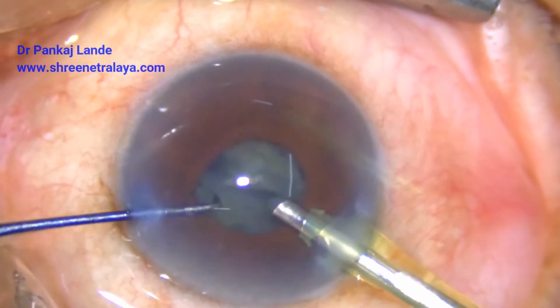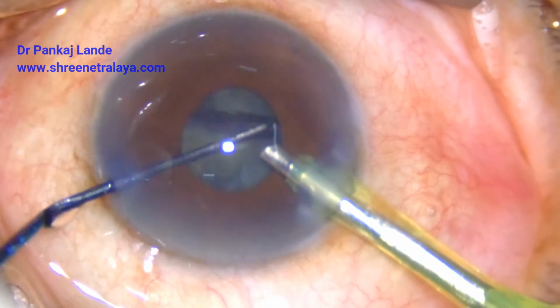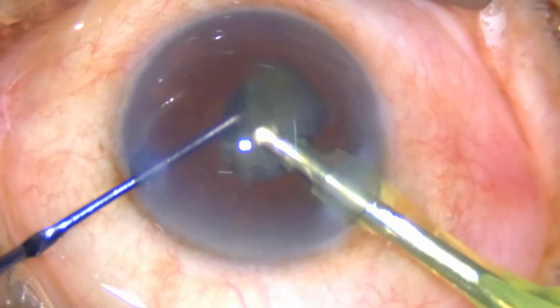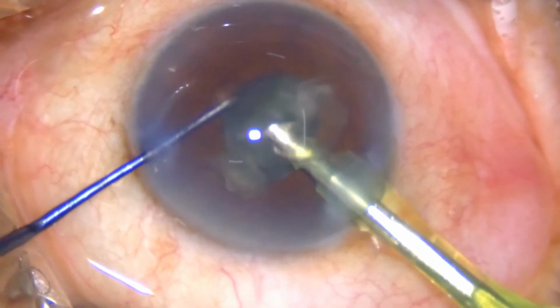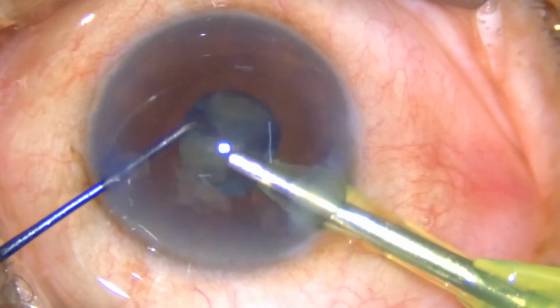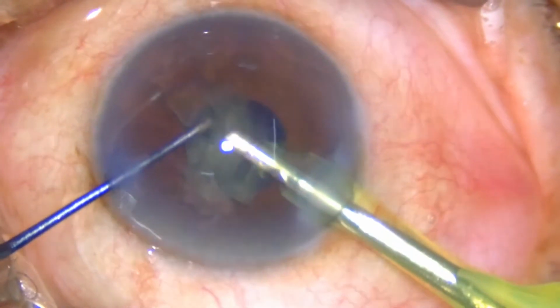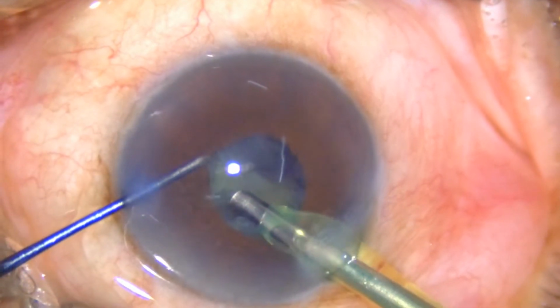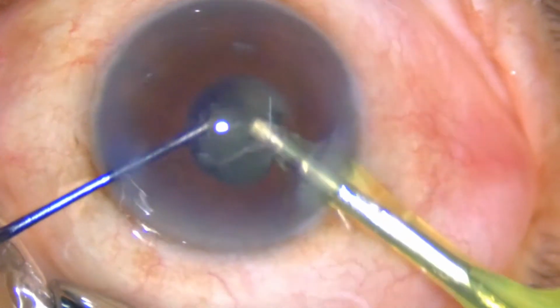If you can't chop, just keep rotating the nucleus and keep eating away the superior pole, cortex and the nucleus. As you can see, I'm keeping my probe very much in the center. Keep eating the pieces one by one. Small pieces, whatever comes in the way, you must finish off first. Do not leave multiple small pieces in the anterior chamber, which can cause endothelium damage.